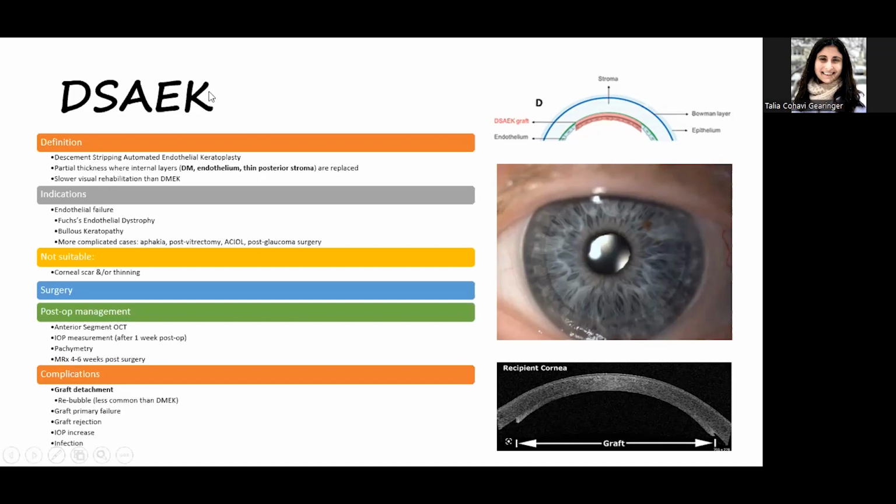Surgeries, I'm going to be talking about in the next slide. But here you can see that this is a slit lamp photo, where you can see this circular line across the cornea. That's how the DSEK really looks on a slit lamp. So that's not sutured in, right? This one, there's no suture, no. Exactly, I'm going to show that in the next slide, but there's no suture in this kind of transplant.